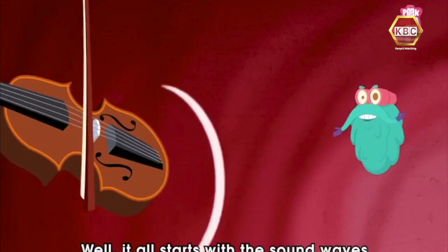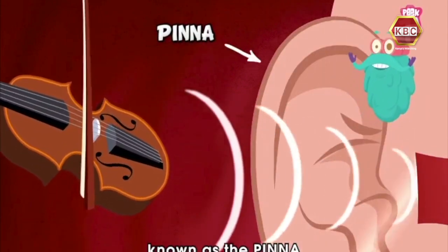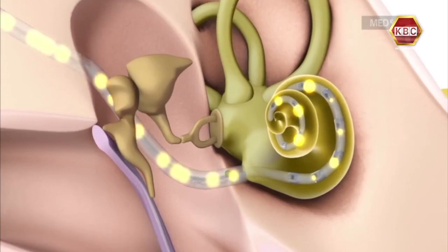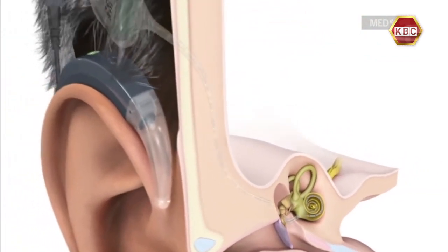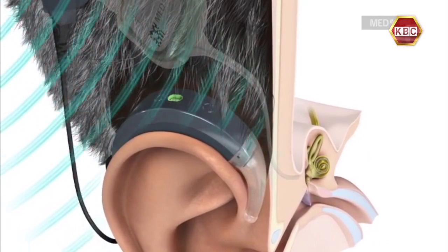After surgery, it is important that auditory verbal training is done to help distinguish different sounds. For a period of around 14 days to 21 days, the site at which the procedure was done will be allowed to heal. The implant that was inserted, that is the receiver stimulator, and the electrodes that were inserted, are allowed some time. And then afterwards something follows. It is now called the activation. Now after the activation, what follows is auditory verbal training.